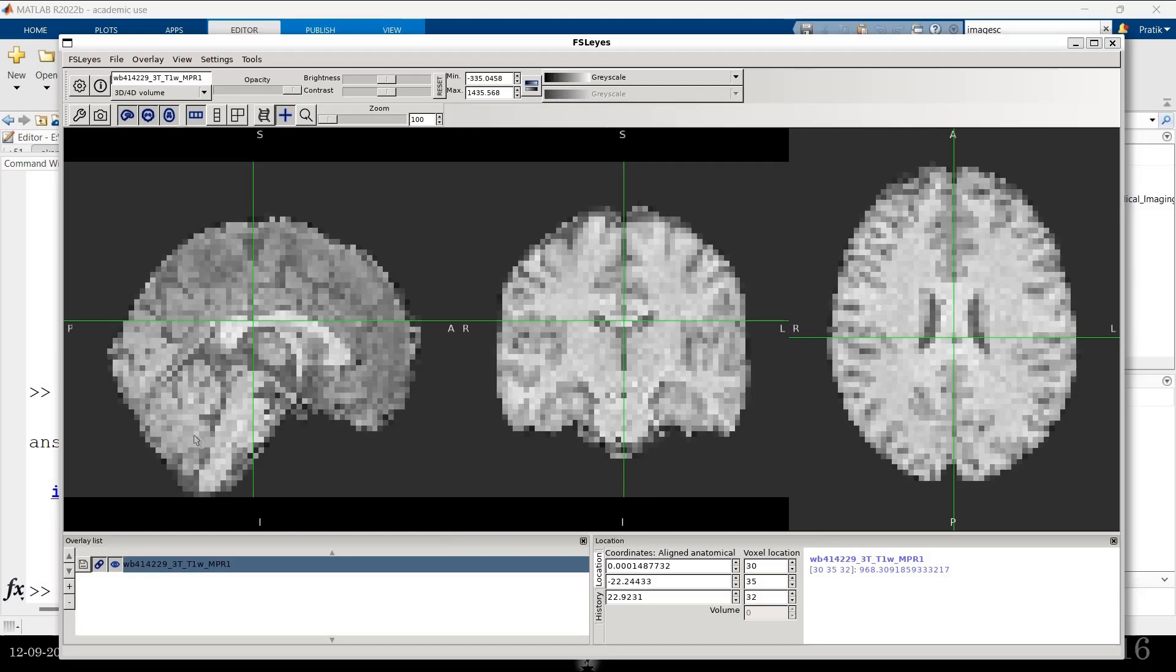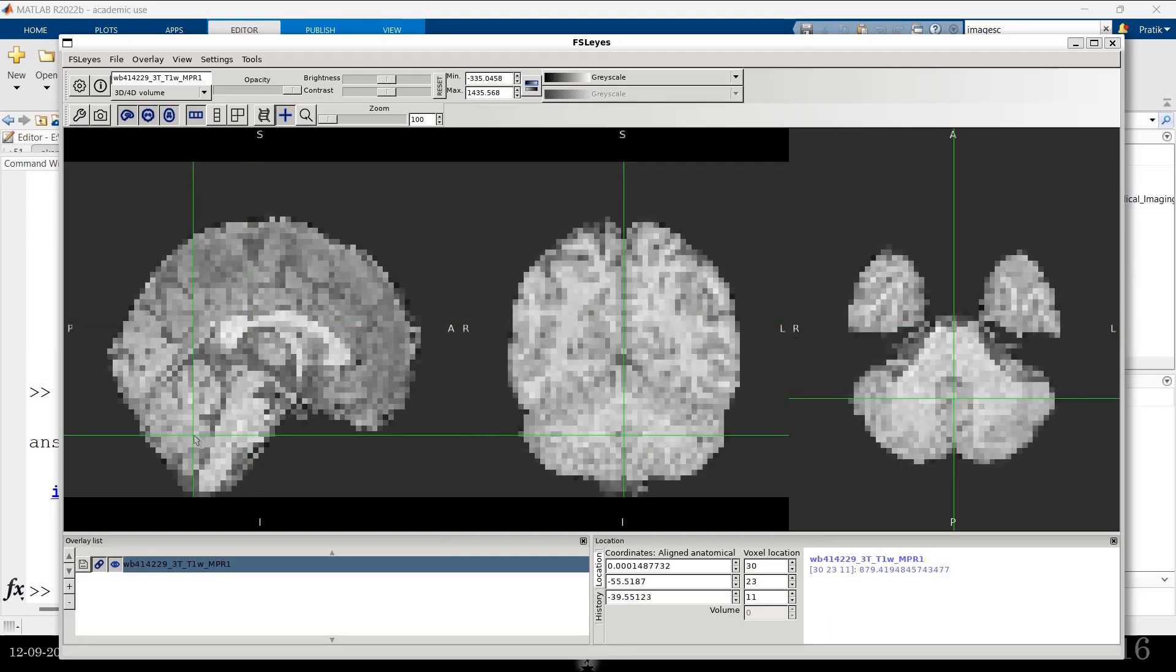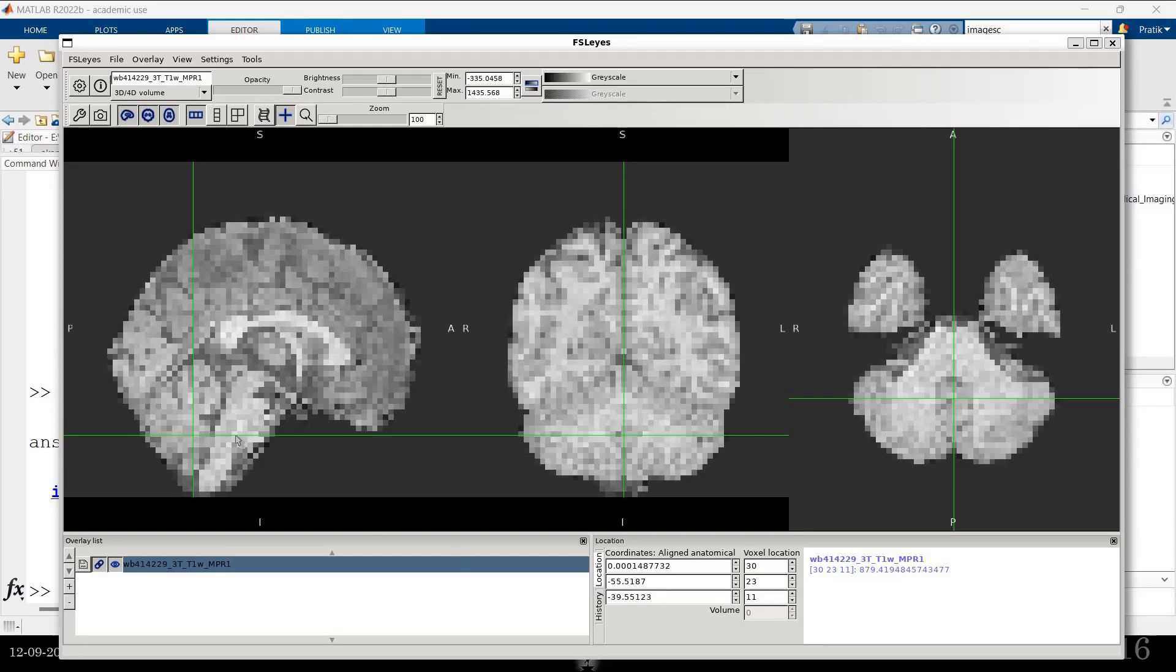If I want to go to the cerebellum, these are the MNI coordinates for cerebellum and so on. Because all the brain images are aligned over here. So it's easier to work in this space. Because I exactly know which region I am pointing out when I am in MNI space.